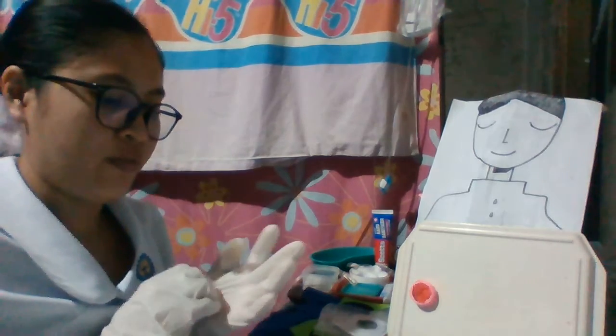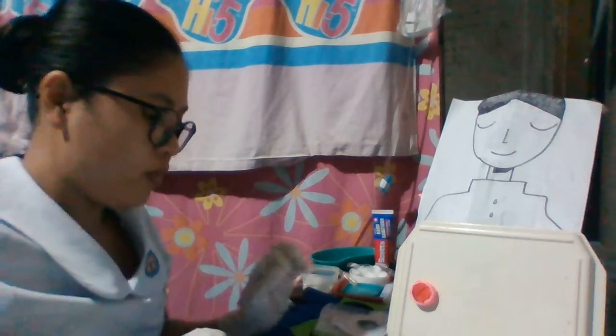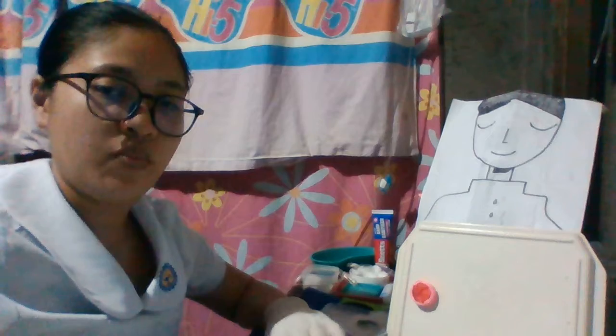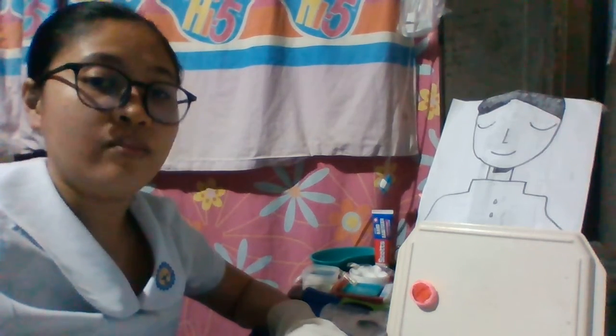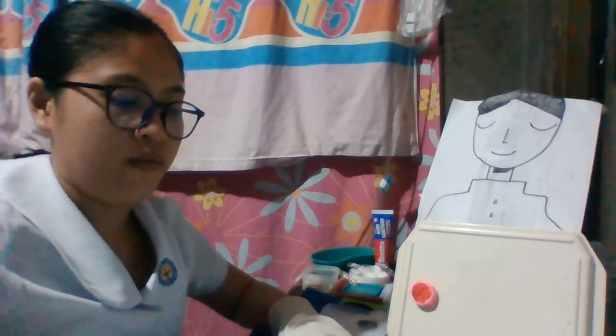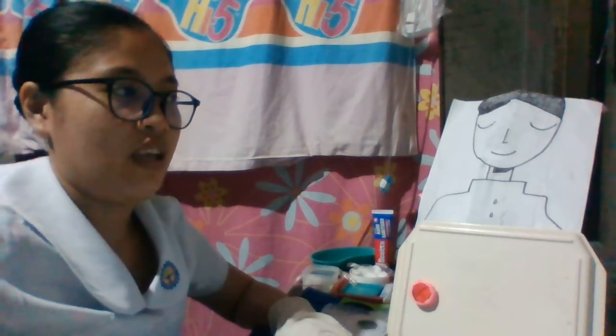If that happens after the pouch is in place, then observe the condition of the stoma and sutures, and encourage the patient to make observations at home, such as if he or she feels irritated.